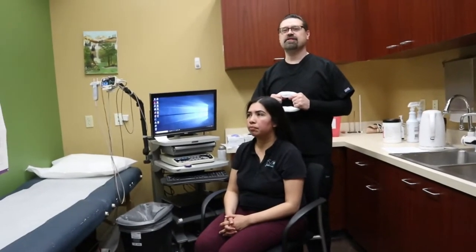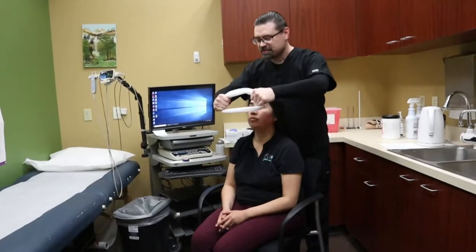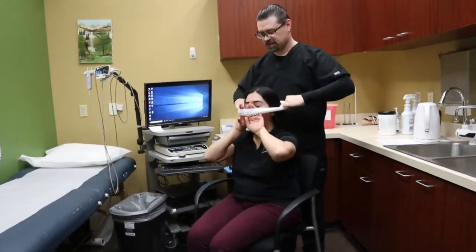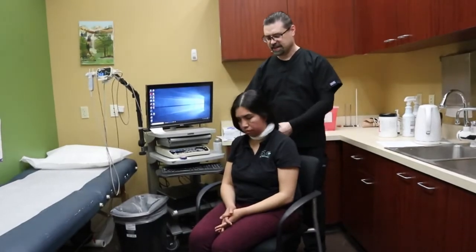The first step is to put the net around the patient's neck. I'm going to ask the patient to help me — we're going to drop this around your neck, grab the front, and drop it around. Then pull the patient's hair outside of the net.